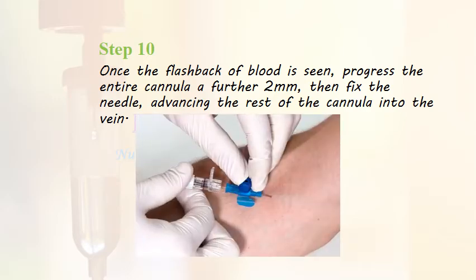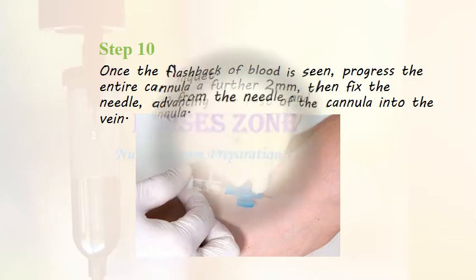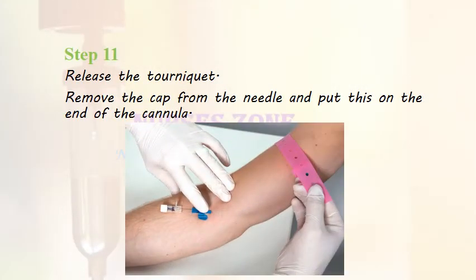Once the flashback of blood is seen, progress the entire cannula a further 2 mm, then fix the needle and advance the rest of the cannula into the vein. Release the tourniquet. Apply pressure to the vein at the tip of the cannula and remove the needle fully. Remove the cap from the needle and place it on the end of the cannula.